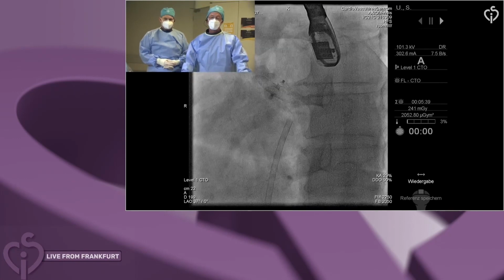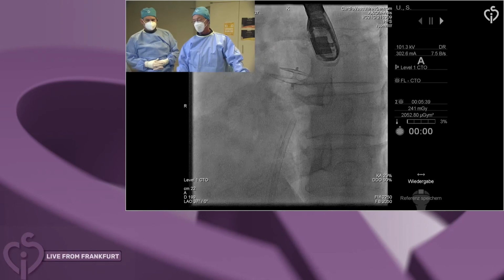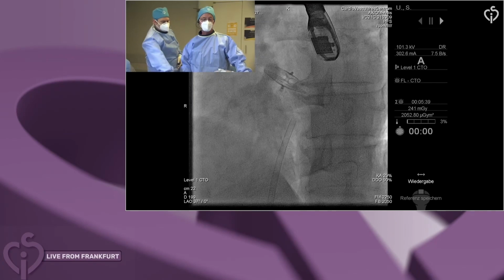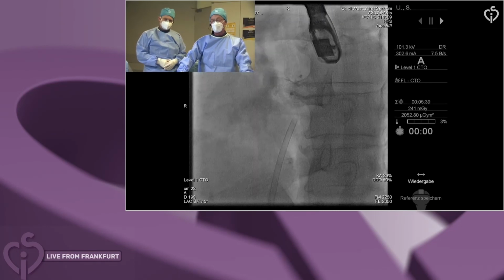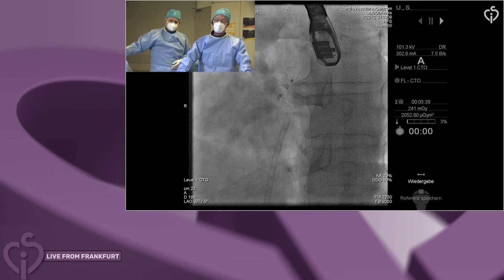But if that happens, that you cover the entire septum and you need access to the left atrium, and there's no space to puncture, then you can go through the device. And this has been shown with all devices. It's a little bit technically difficult, but it works quite well when you know how to do this. You have to cross with a wire or puncture, and then go with PCI balloons and dilate it up to the required diameter. So you can puncture these devices. But yes, that's another good reason to pick the smallest device which is able to close the hole.